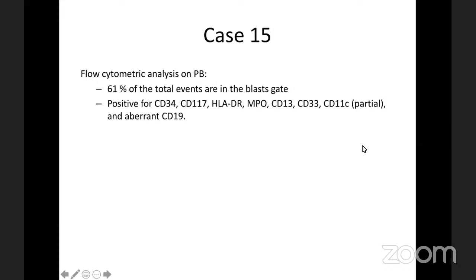Any specific cytogenetic abnormality in this case? I'm looking into the Q&A. After looking at this immunophenotyping and the morphology with dysplasia in the peripheral blood, yes, most of you got it. Naif, Ashsana, Bushra, all of you are correct.